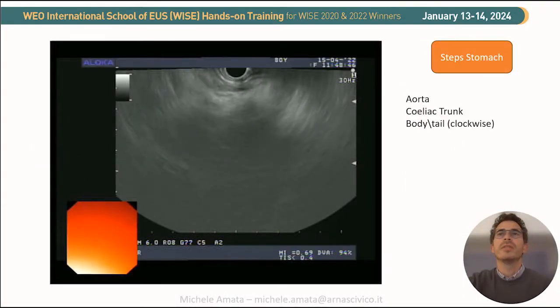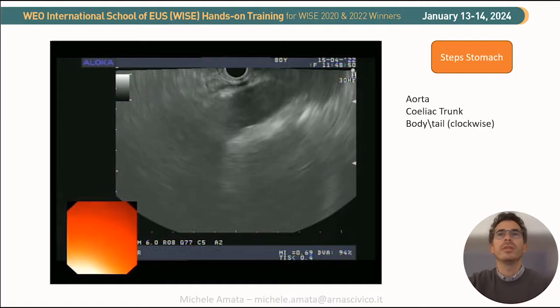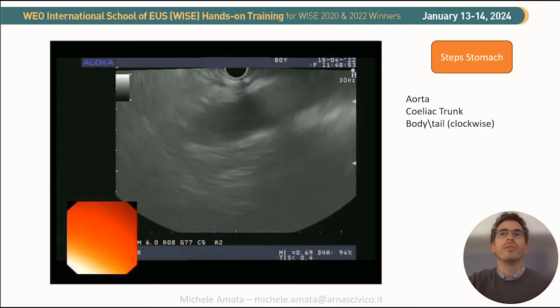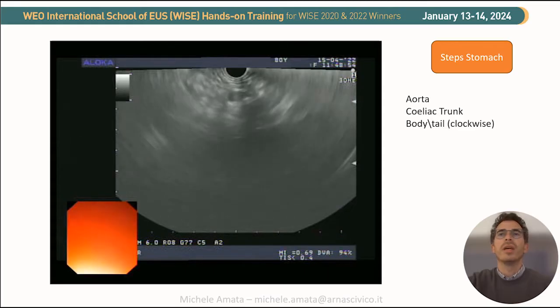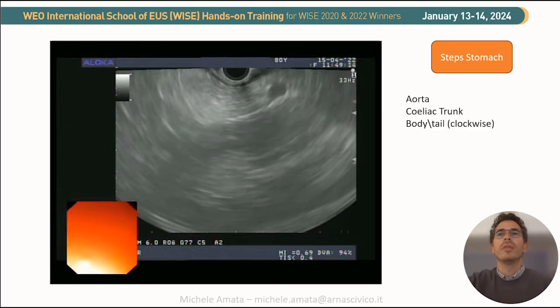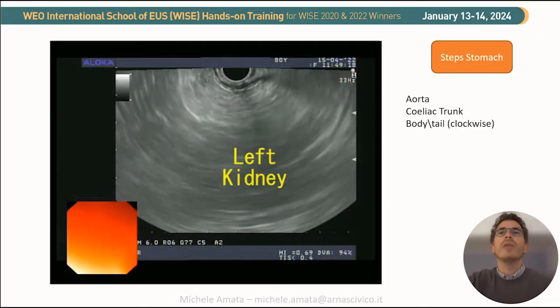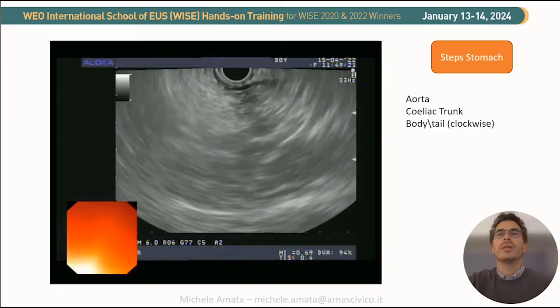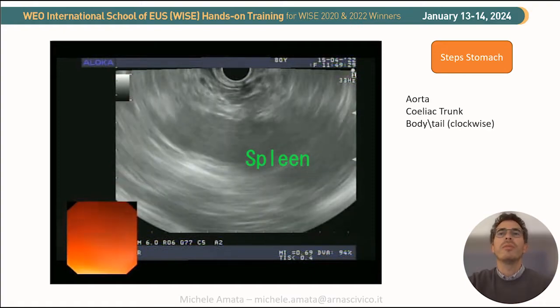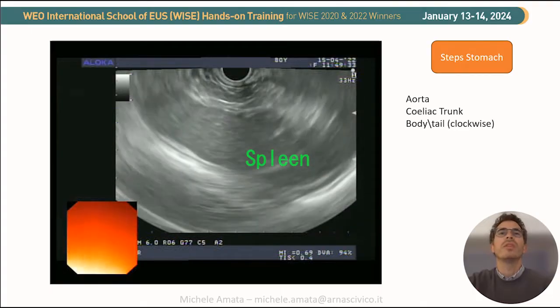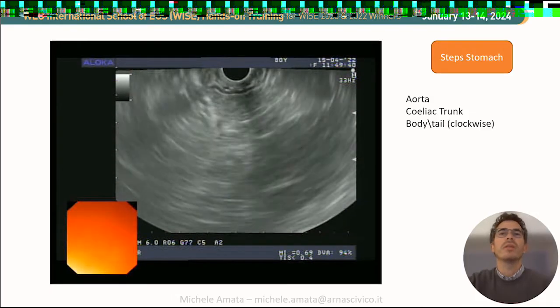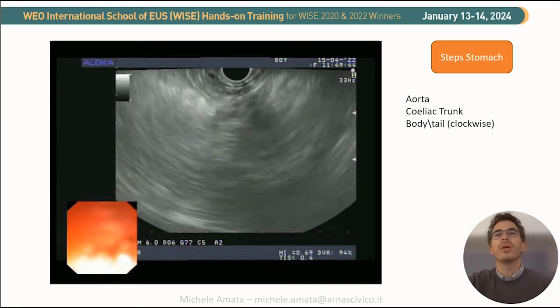To summarize: we see the liver, and moving clockwise we will find the aorta. Advancing the scope further, as soon as the crus disappears, we look for the celiac trunk coming off the sides of the aorta. Distally we can also see the superior mesenteric artery. Advancing further and pushing down the up-down wheel, the neck of the pancreas comes into view. Torquing clockwise, a little of the body comes into view and we trace the MPD. At the bottom of the screen, below the pancreas, the left kidney comes into view. We fully interrogate the tail of the pancreas by turning clockwise and counterclockwise until the organ disappears from one side to the other.